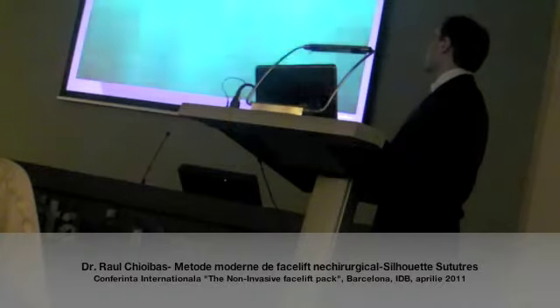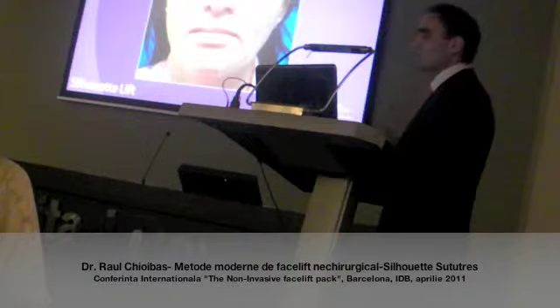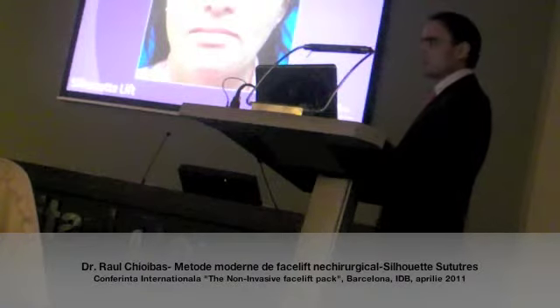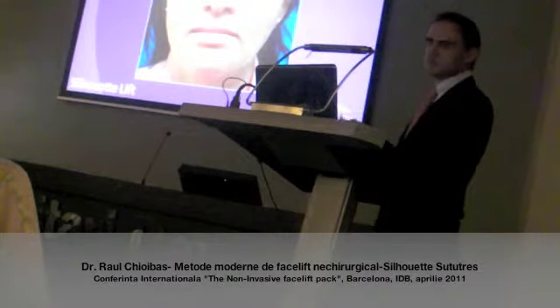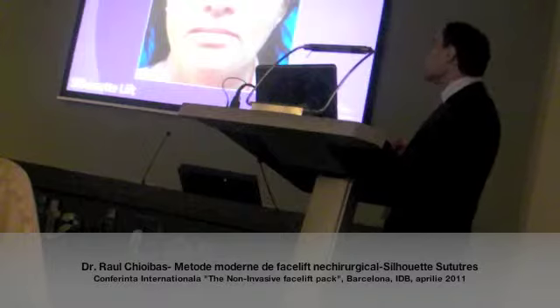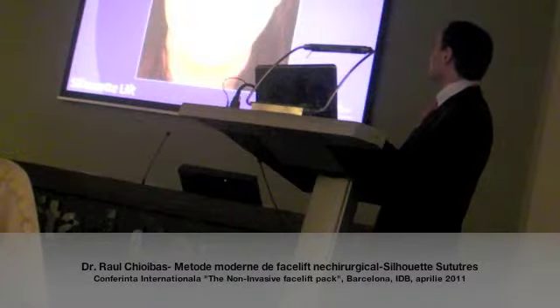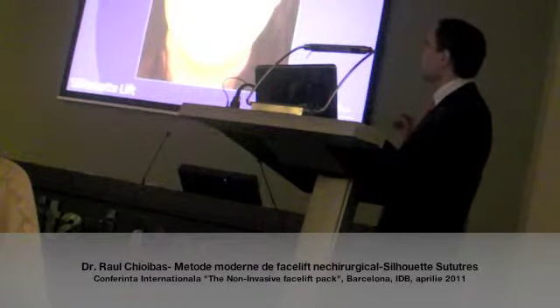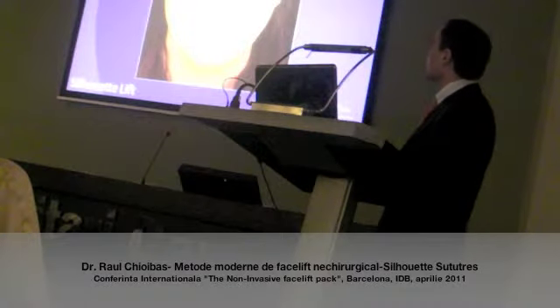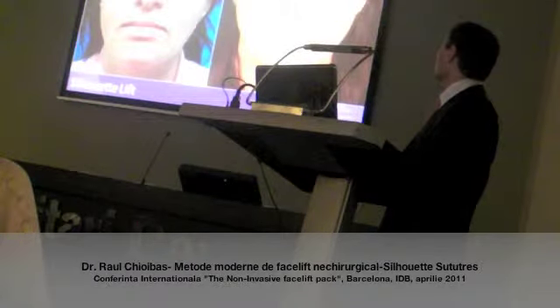And this would be the suture insertion, which I'm not going to explain, because these are some cases that we have, and we don't have very broad experience. It's only a few months, between 5 and 7 months. But we have some cases and some results after this time. So this is a case where we've done only a silhouette lift without any adjunctive technique. Only that we've put some hyaluronic acid in the tear trough in this area, and this is the result after 7 days.